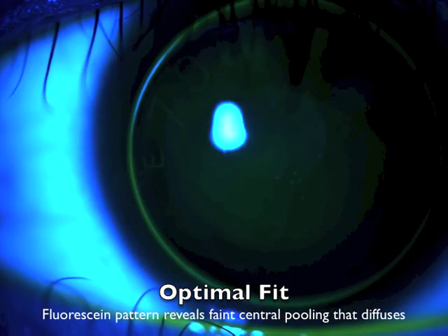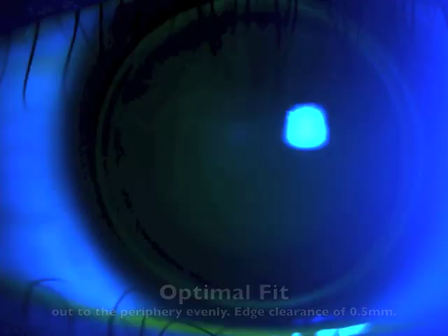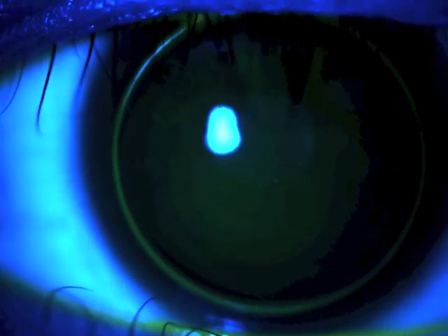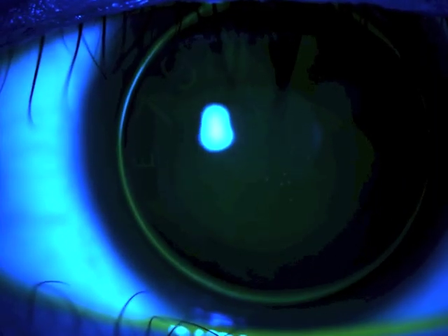This is the ideal lens fit of an RGP lens. As we can see, there's even pooling throughout the lens, meaning that there's even pressure exerted all around the cornea. There's also an optimal edge clearance of around 0.5mm all around the lens, and a movement of 1.0 to 1.5mm. This is essential for good tear exchange in the eye.